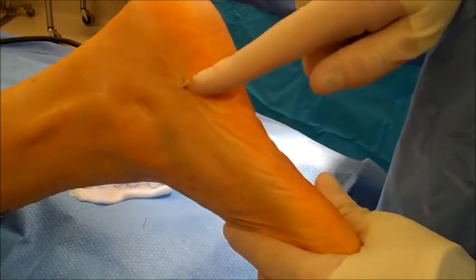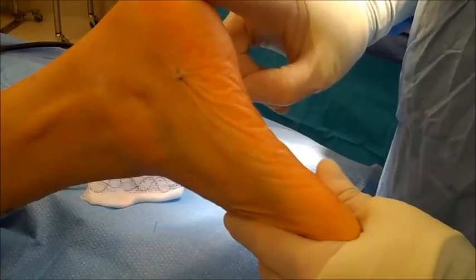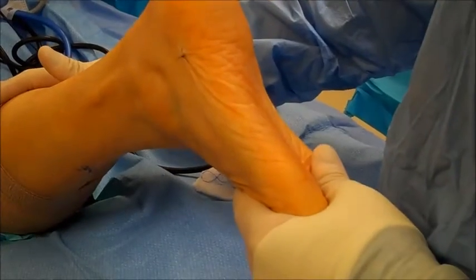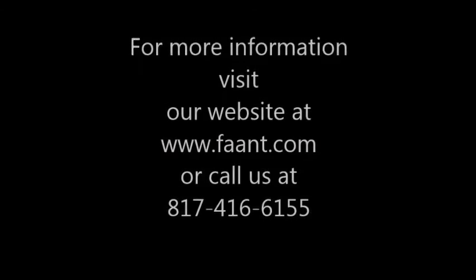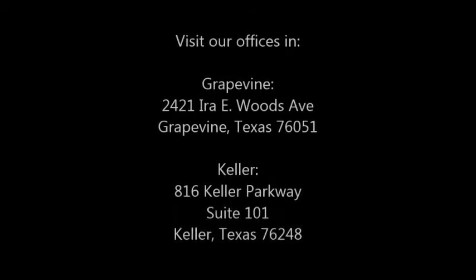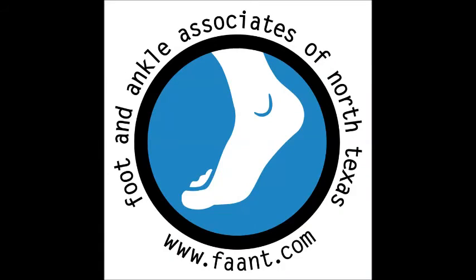We finished the procedure. There's an incision here and an incision here with one stitch on either side. The patient will be placed in a below-the-knee walking boot for approximately four weeks. After four weeks, she'll go into an athletic style shoe, and in about eight weeks she's back to full normal activity.